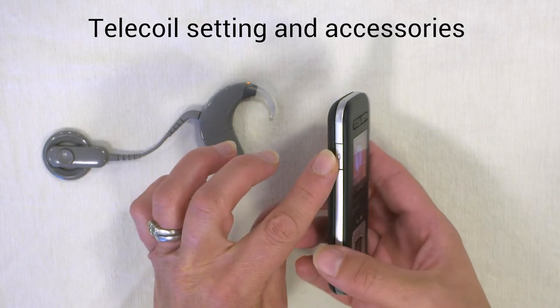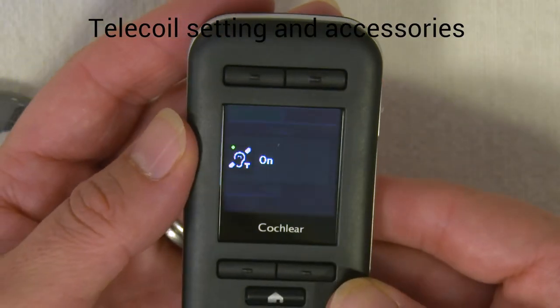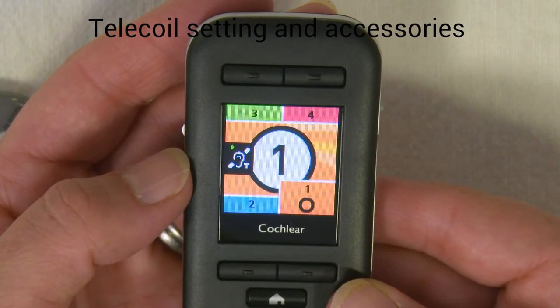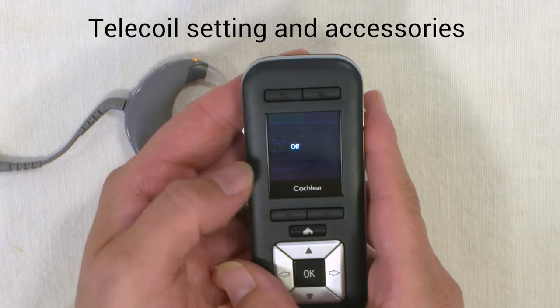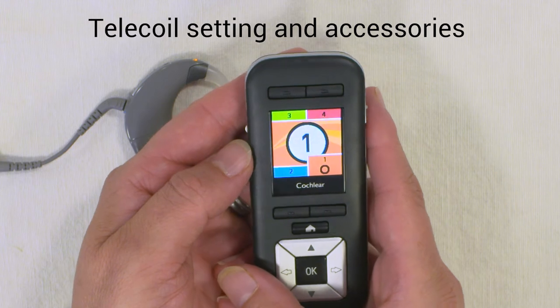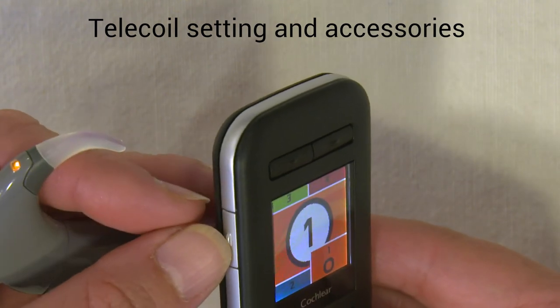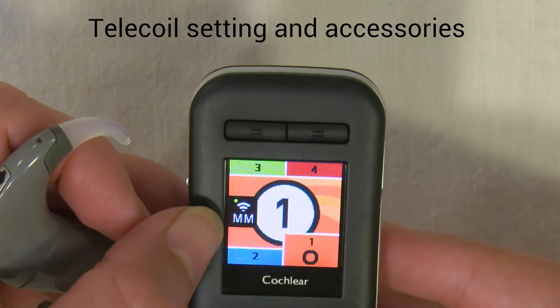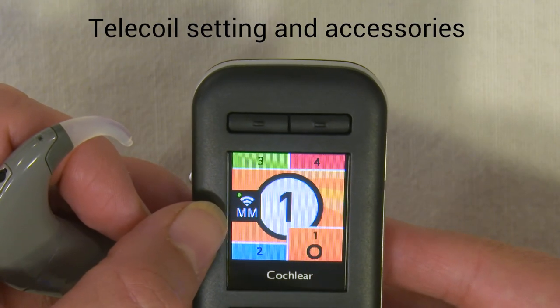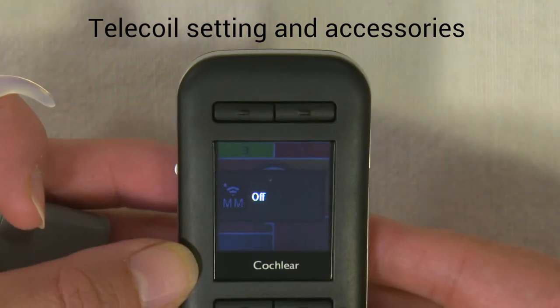The button on the side of the remote is used to put the processor onto the telecoil setting. A quick press shows 'telecoil on' on the screen, and the telecoil sign remains there as long as it's on. Another quick press switches it off and it disappears from the screen. The same button is used to connect to wireless accessories such as a mini mic — press and hold the button, the light flicks blue, and on the screen you get the MM sign for mini mic. Press that button again to switch it off.